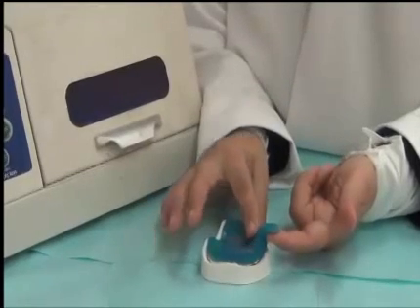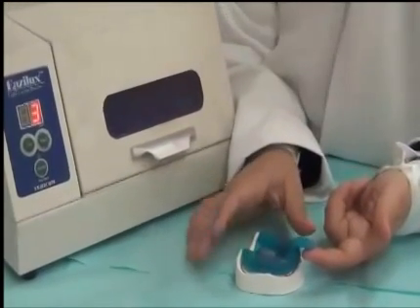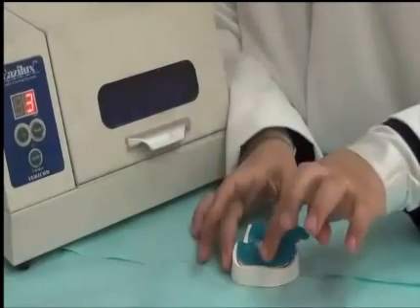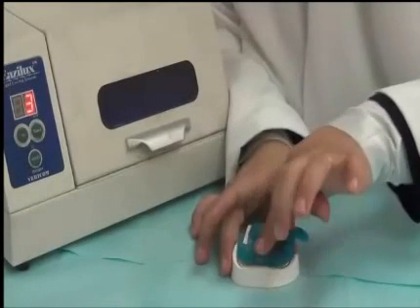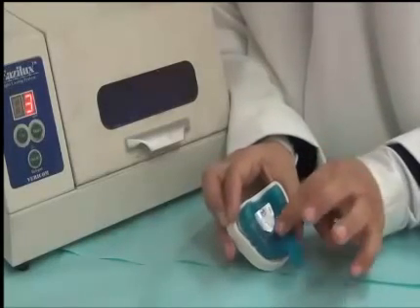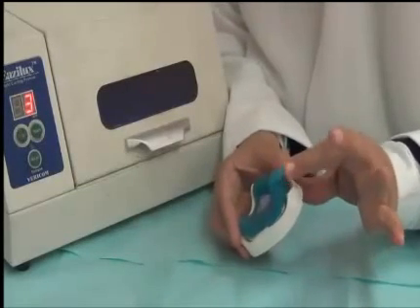Another issue is that the light cure acrylic material has what we call an air-inhibited layer. This layer does not fully set on the surface because of its contact with oxygen. So we could add Vaseline to the surface. This will reduce the air-inhibited layer. And also Vaseline will aid in the fusion of the body of the handle to the tray material.